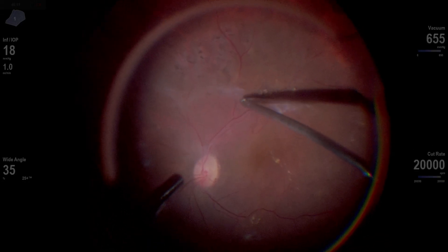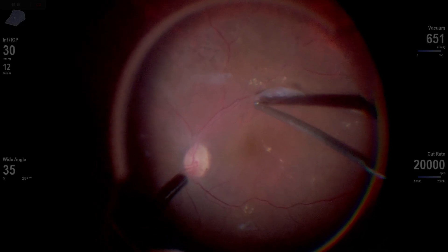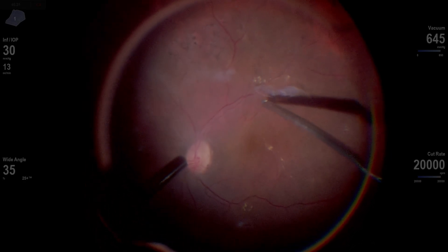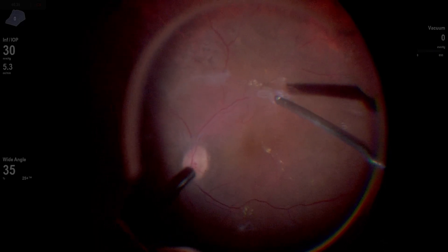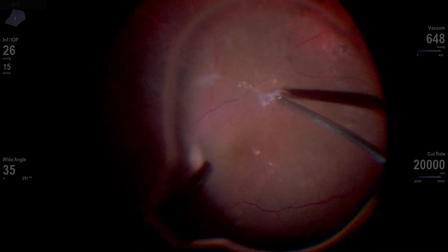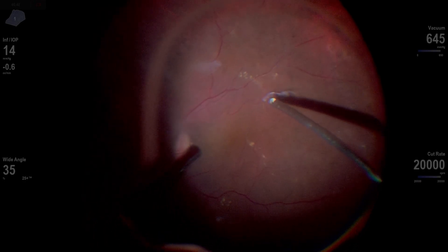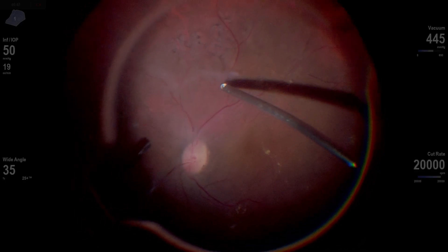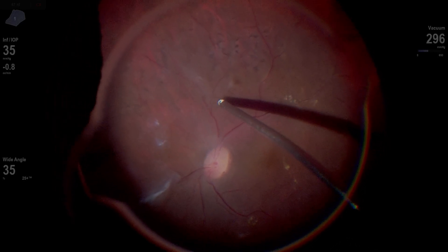Now we're going to attack it from the other direction. I aspirate and I'm actually able to lift it, then cut and create a nice segmentation there. I like to segment my cases with diabetic fibrosis. Now that I've got that segmentation, I'm just dealing with this plaque along the superior temporal arcade — it's pretty mobile. I can get my cutter on one side and use this high-speed cutter to aspirate and cut along the edge of the fibrosis. It'll just fold into your cutter as long as you're right on the edge, and that allows you to get the fibrosis off without having to aspirate and pull.